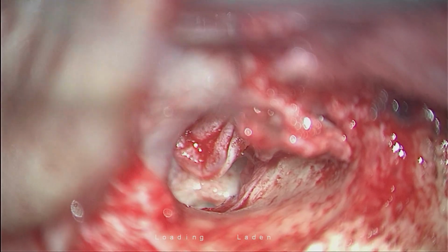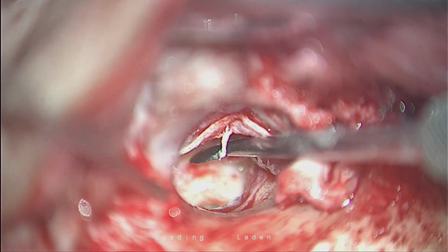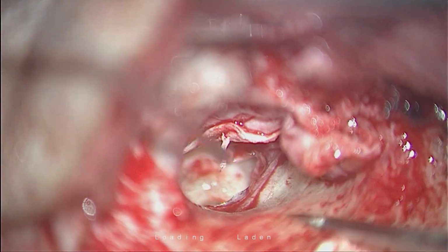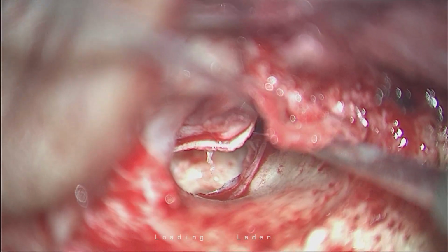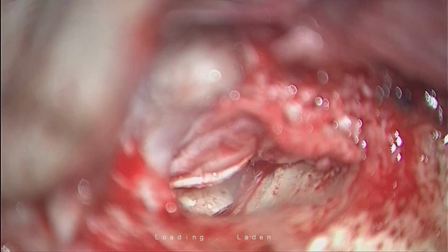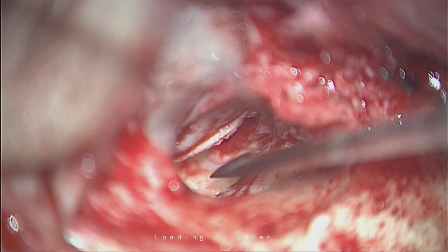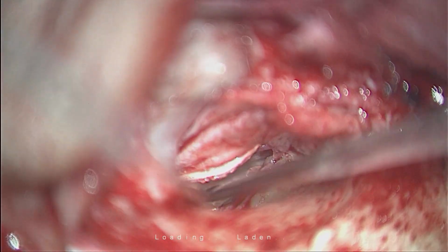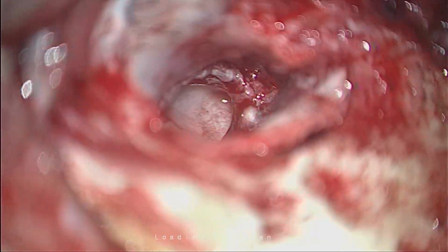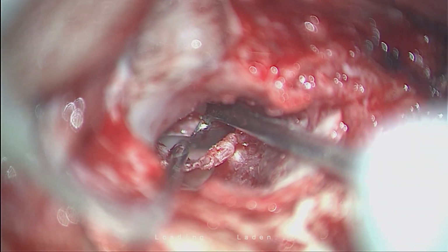No, it is not divided, it is retracted. See, what is this mucosa? It's the same mucosa which is lining the promontory. It's draping all around the middle ear walls and then coming underneath the tympanic membrane. Sir, sometimes in a larger perforation, the posterior mucosal layer is also missing. It is not missing, it retracts. This mucosal layer is a small layer and it can retract behind. So it can just retract, which you are describing as missing. So it is not as prominent as the superior one. It depends upon the site and size of the perforation. So all around, what we have done is separate the mucosa from the other layers.